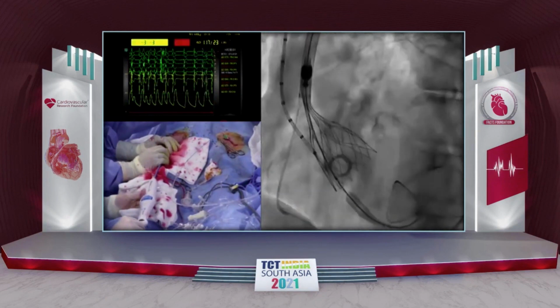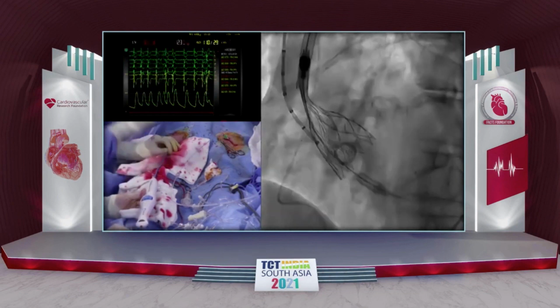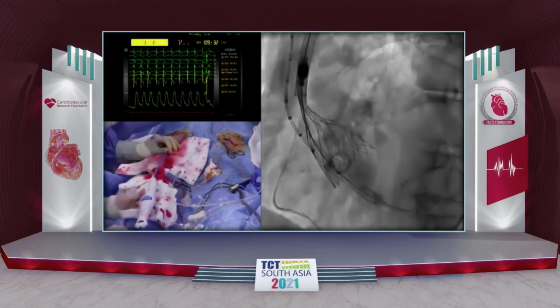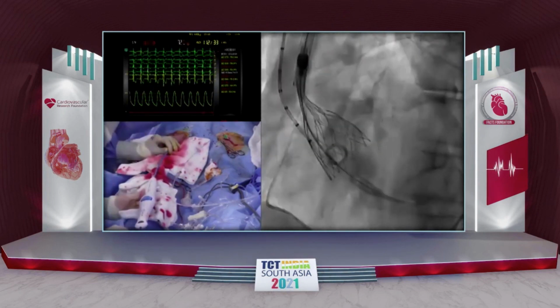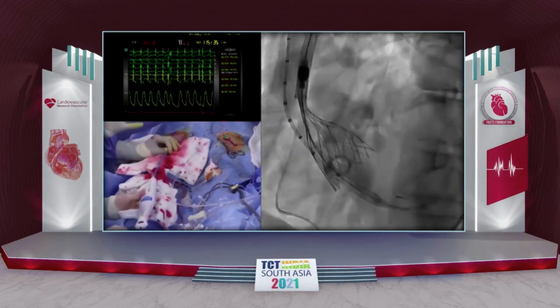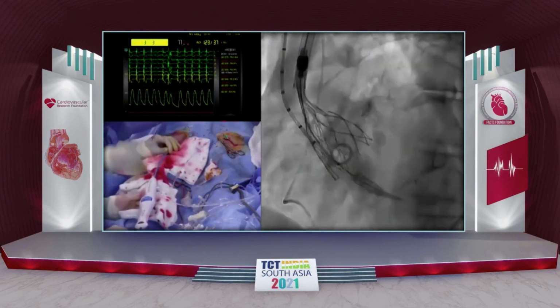So the patient obviously had quite significant AR during the procedure. You saw that the hemodynamics dropped quite significantly. And I think that is due to the significant calcification in the BAV, and even with the 18, it clearly had torn the non-coronary cusp or leaflet completely away, giving effectively free AR. She has recovered quite nicely now. You can see the hemodynamics a lot better.